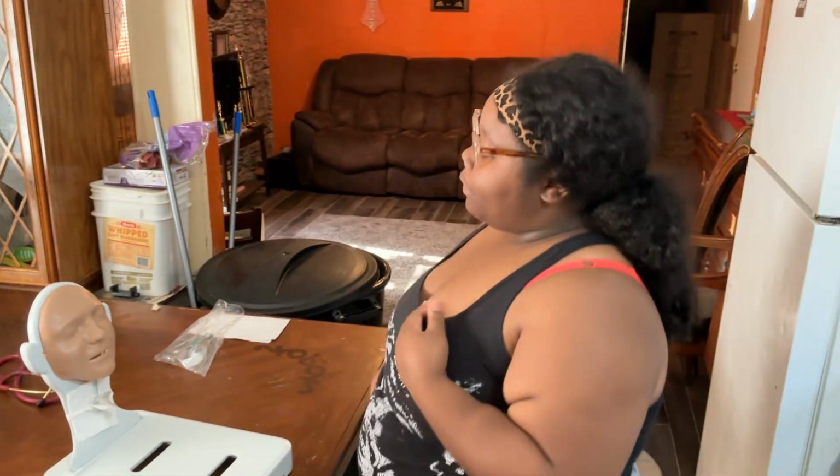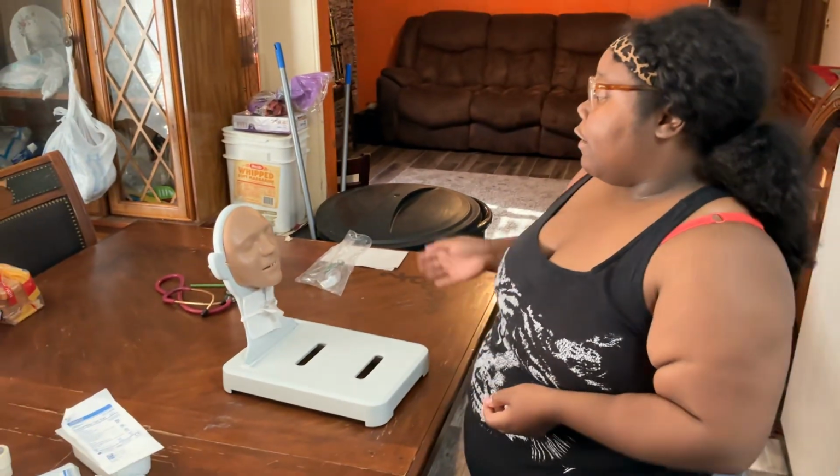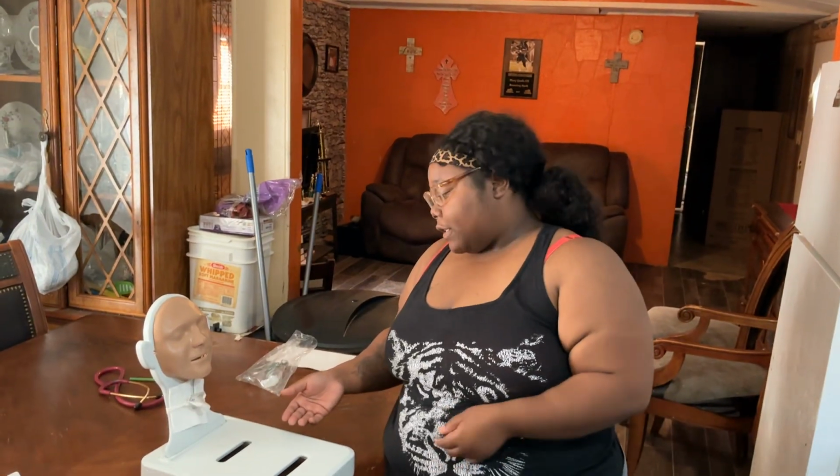Hi, my name is Alicia. I'll be your student nurse today. I'm here to perform trach care on you and suctioning as well. Before I get started, can you tell me your name and date of birth? Her name is John Doe. Birthday is 12/2/2001. Okay, Miss John Doe, can I see your wristband so I can verify that? Okay, I verified name and date of birth on wristband. It is accurate. John Doe, 12/2/2001.